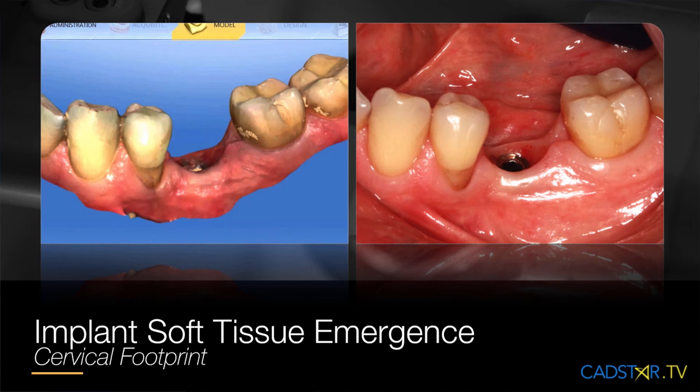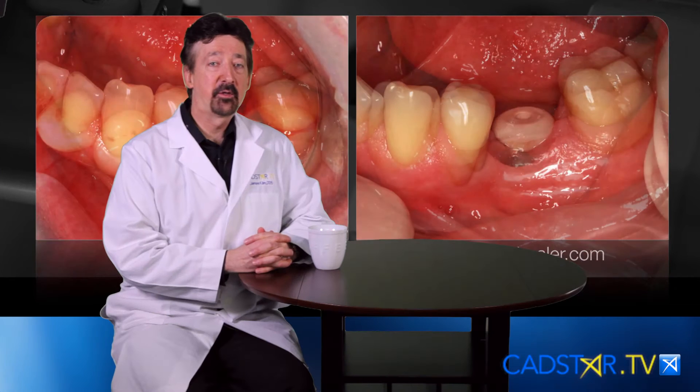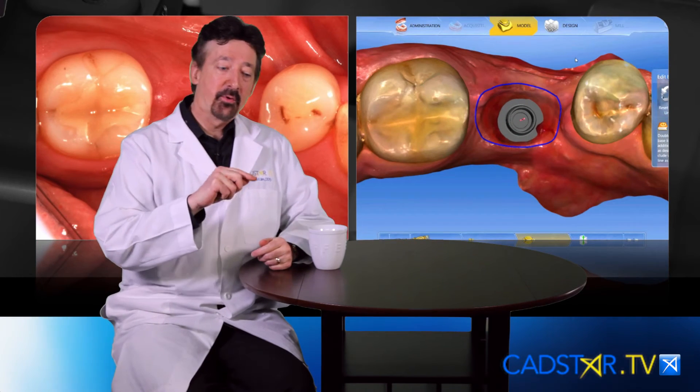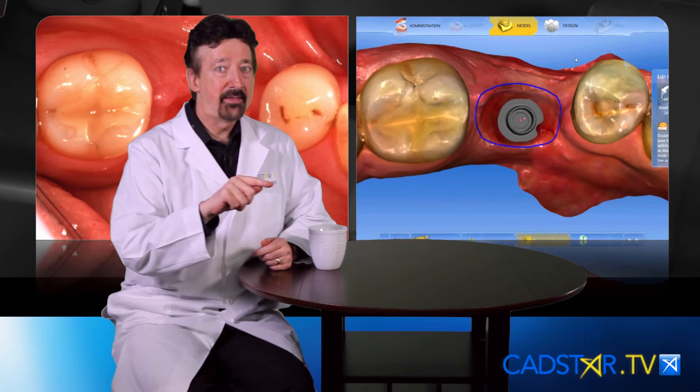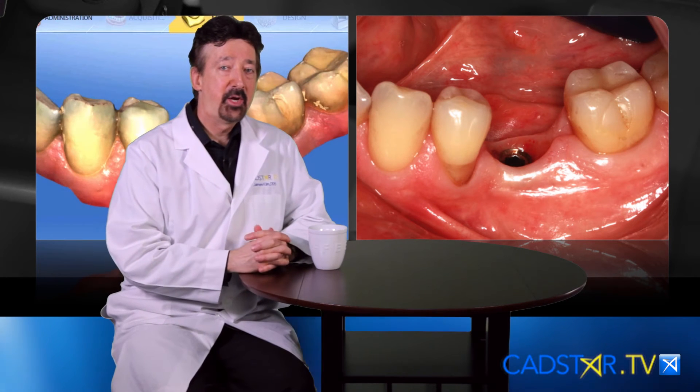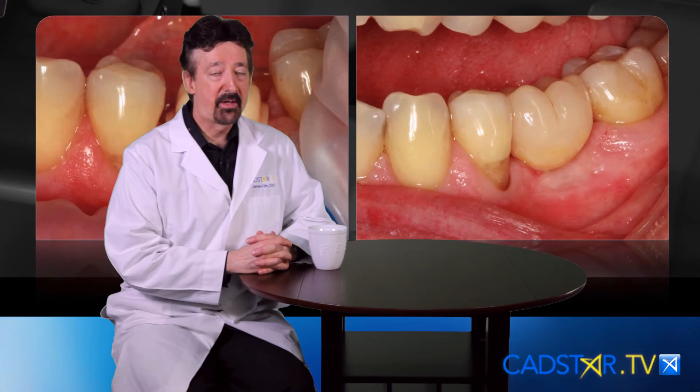The best way to operate with the CEREC system is to pre-form your soft tissues. That way, when you draw your baseline, you draw it to the height of contour and that so-called free gingival margin, and your proposal doesn't require a lot of work.